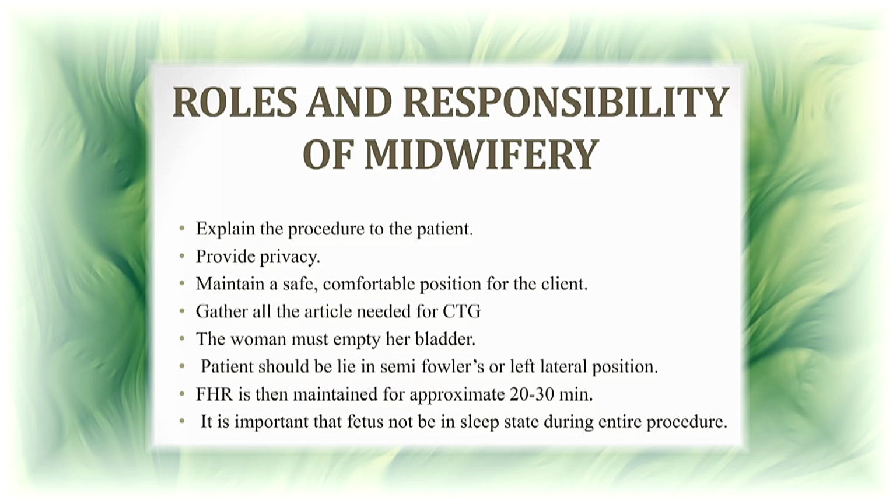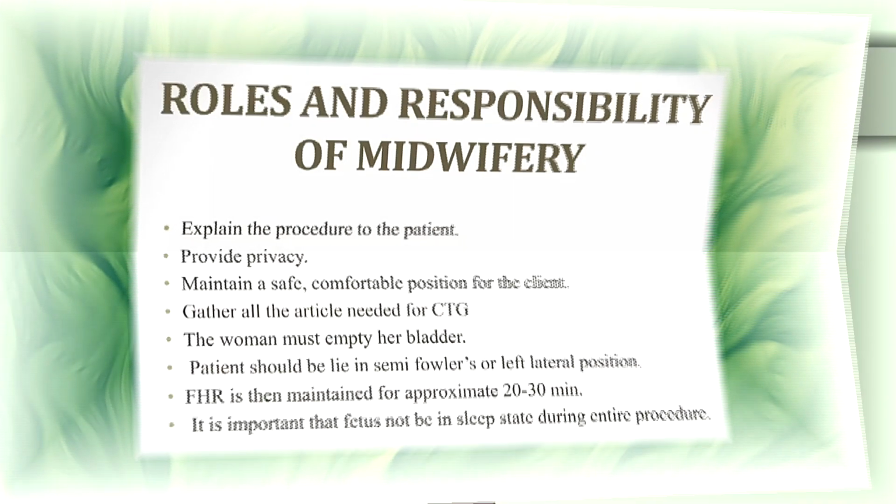The woman must empty her bladder. The patient should lie in semi-Fowler's or left lateral position. Fetal heart rate is then monitored for approximately 20 to 30 minutes. It is important that the fetus not be in a sleep state during the entire procedure.